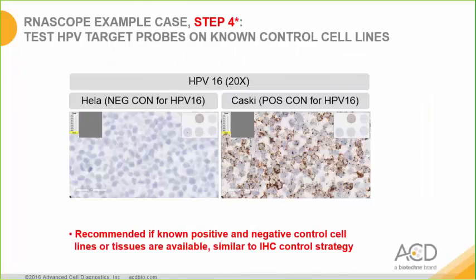An optional step 4 can be performed and is recommended if known positive and negative control cell lines or tissues are available, similar to IHC control strategy. In this case, the CaSki cell line, which is known to be positive for HPV 16, and the HeLa cell line, which is known to be negative for HPV 16, are employed to demonstrate specificity of HPV 16 probe staining. Here, the HeLa is completely negative, while the CaSki is positive for HPV 16.